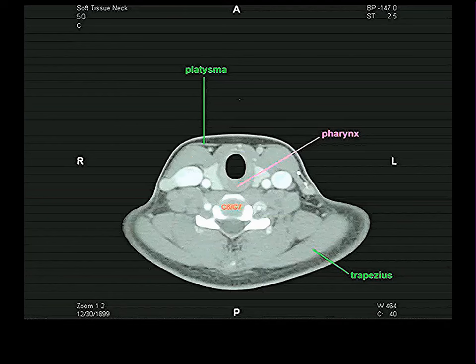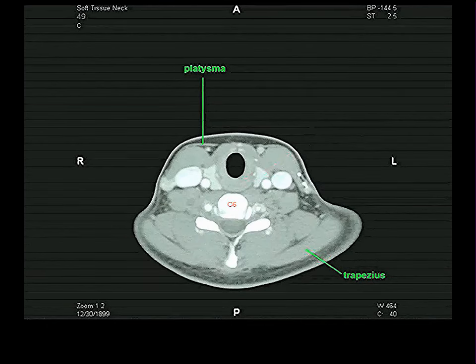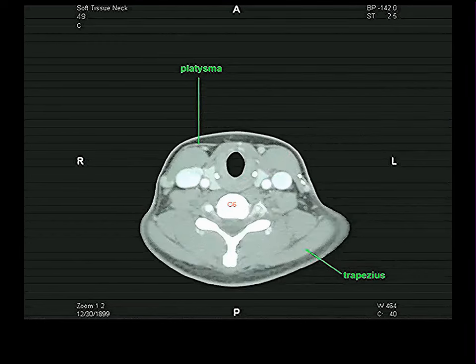So this is the 29-year-old woman. The wall is no longer concave or indented or flat. We are therefore at the level of the cricoid. I don't see the cricoid. She doesn't have a calcified cricoid. She's a young woman. But I know when that wall becomes curved and is no longer flat or indented, it is the cricoid, which made me change the name of that from esophagus to pharynx. Keep on going up. Even nicer cricoid area.